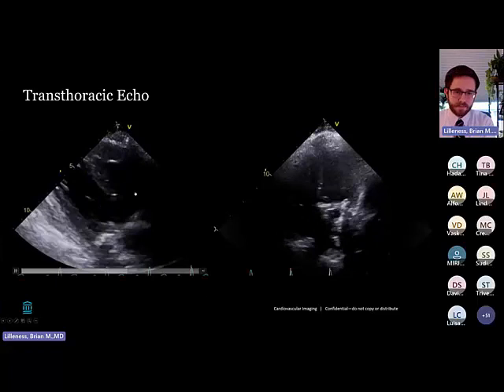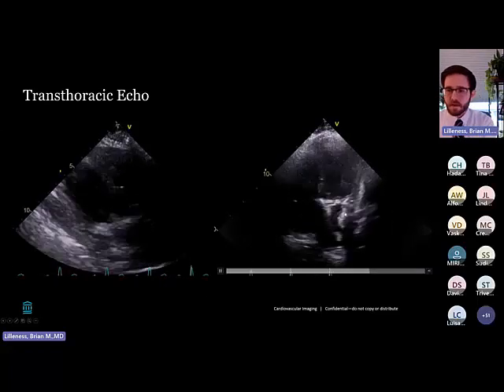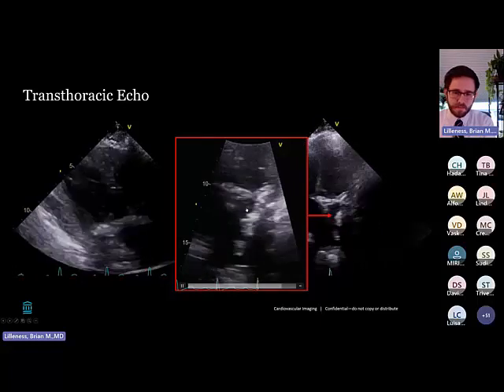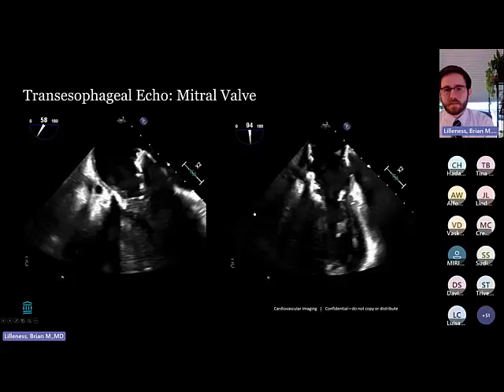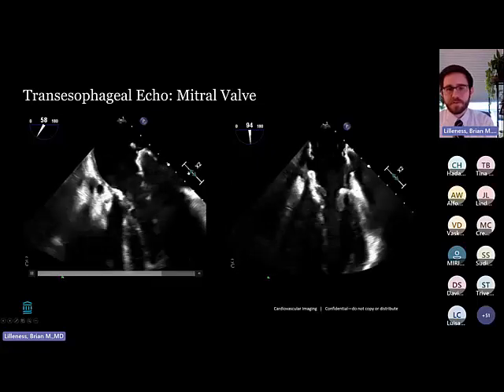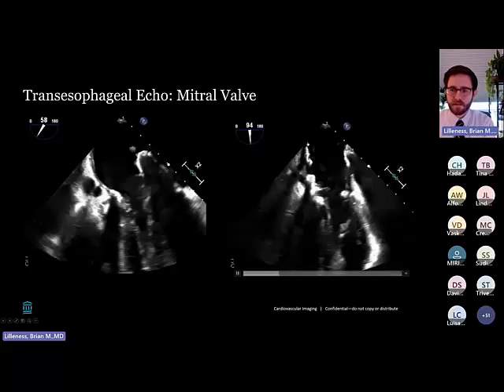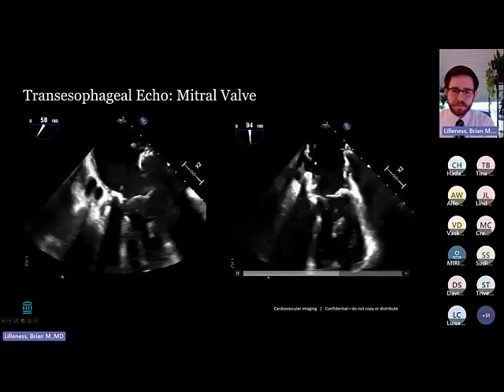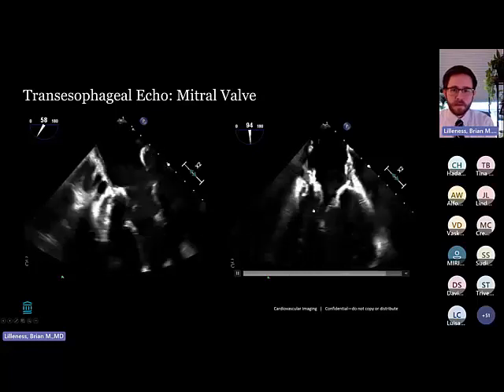It's really hard to actually see the aortic valve prosthesis, and you can see there's a ton of mitral calcifications. On closer view, though, here, you can see there's maybe something that's kind of mobile here. So we moved on next to a transesophageal echo, which is most remarkable for the significant number of vegetations that you can see here in the left atrium up above. In fact, we counted four at one point, which you can see all along here in this two-chamber view.